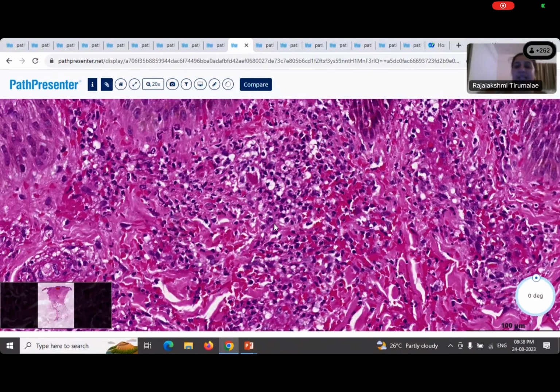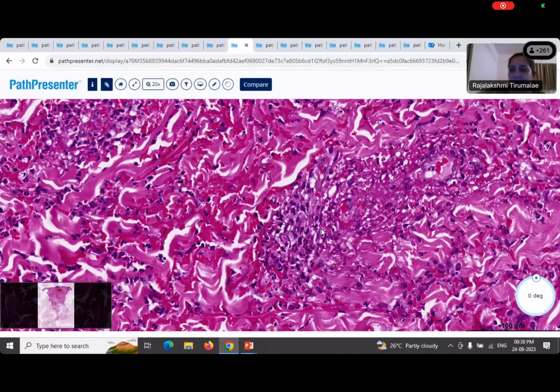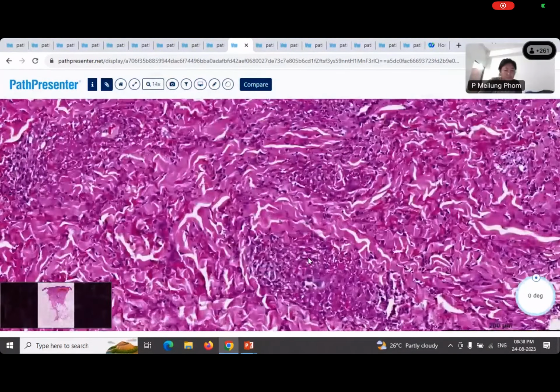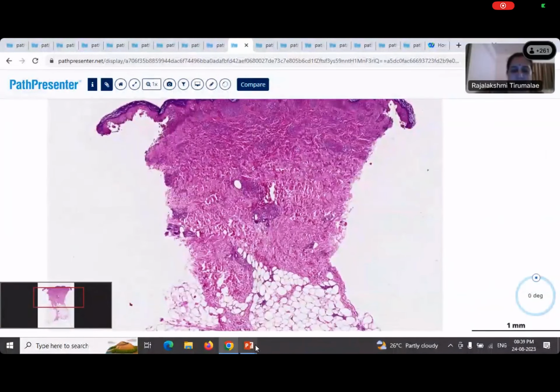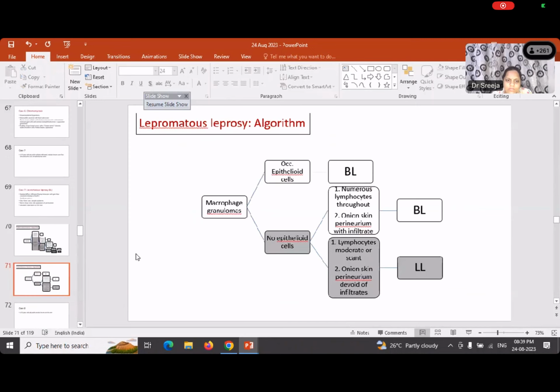That would perhaps be obvious in a little earlier lesion. This is a well-developed lesion. So you do have some amount of neutrophils in the infiltrate and very little nuclear dust or karyorrhectic debris, as you see, right? So what do you want to call this? Leukocytoclastic vasculitis. Okay, so you would want to call this leukocytoclastic vasculitis.